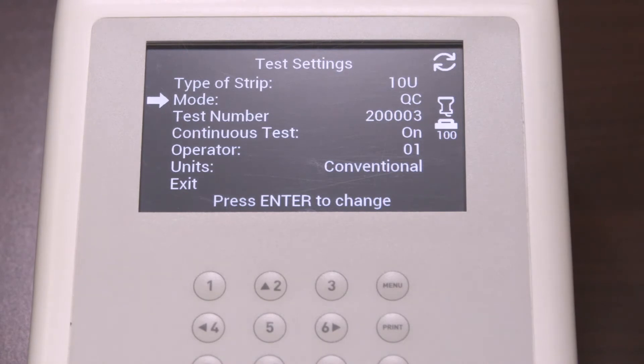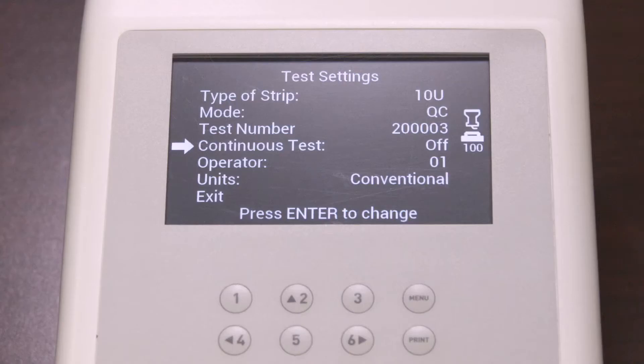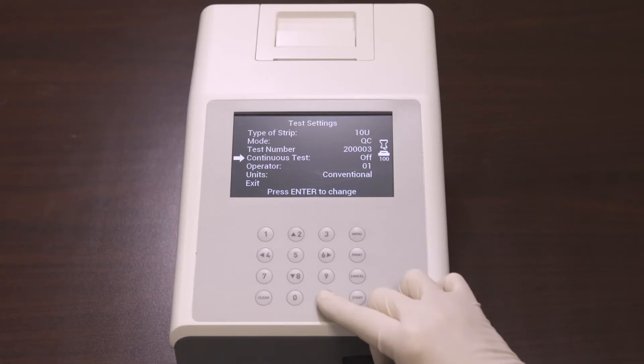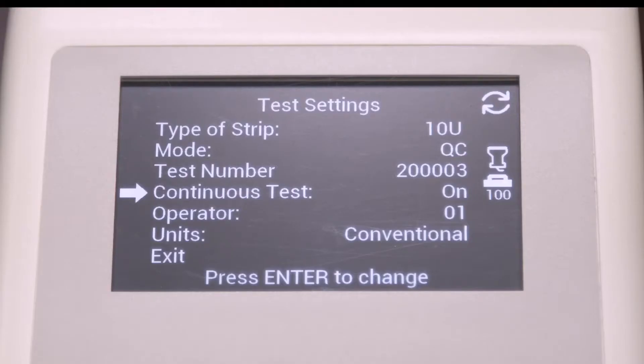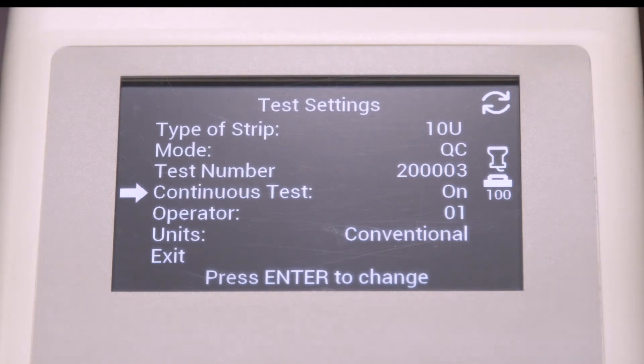The first digit is fixed and cannot be changed. Next, in the test settings after test number is continuous test. Select continuous test and press Enter to cycle the settings to off or on. If continuous test is off, you can test one strip at a time, which is also called single test mode — this performs 60 tests per hour. If continuous test is on, you can use test strips one after another, performing up to 120 tests per hour. The circled arrow symbol will be displayed when continuous test is on.